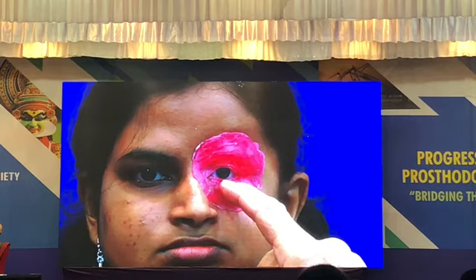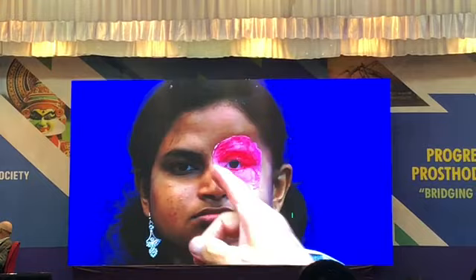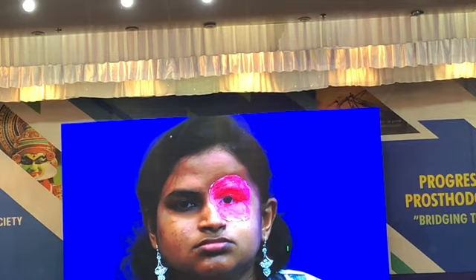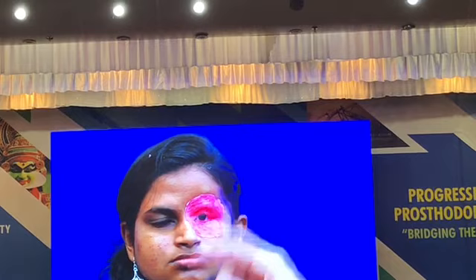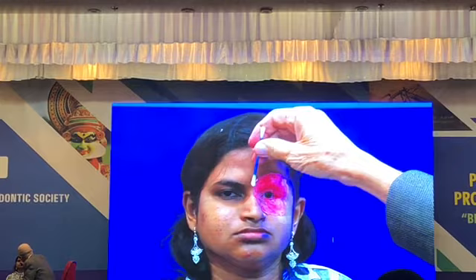Now this sculpture is okay, but the problem is the depth. I can't get the globe far enough back. I don't know if you can see that. It's hard because there's a big shadow there, but the big problem is the skin is right there. Right here, and the globe has to go back a good, I would say 2 millimeters in order to create the depth in this area here that she has on the opposite side. It's hard to see that on the picture. Well, you're starting to see it now, but you see the big shadow that she has on this side? We can't recreate that if we don't have the depth. Now you can try to paint that into the prosthesis, but it really won't look very good unless you have the actual same depth here as you have here.